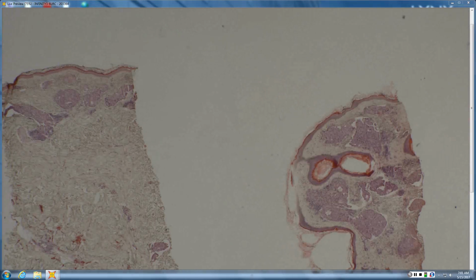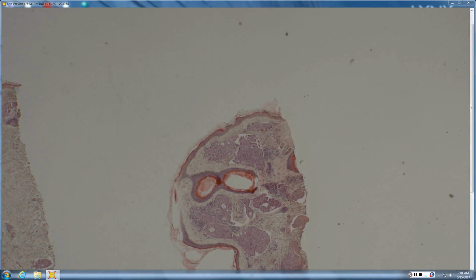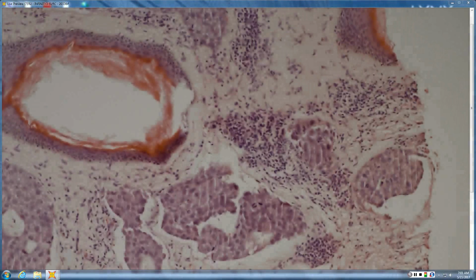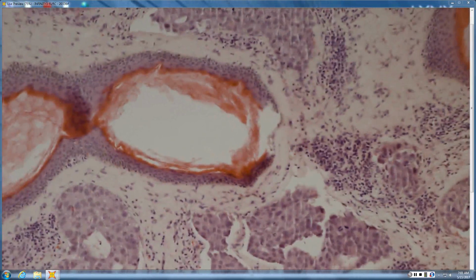Okay, and then this is another one of inflammatory breast carcinoma. And you can see here, pretty small little punch, but these large epithelial islands, atypical cells that appear to be floating and most likely are within lymphatic spaces, producing that kind of inflammatory clinical appearance.